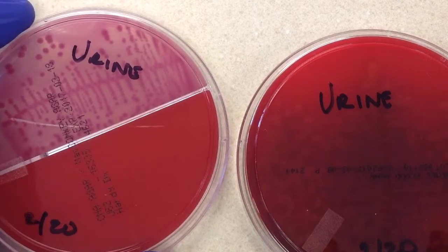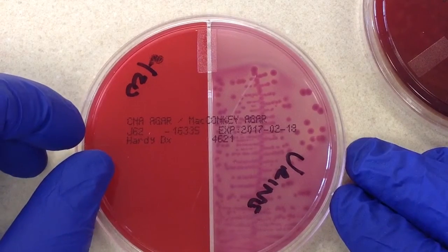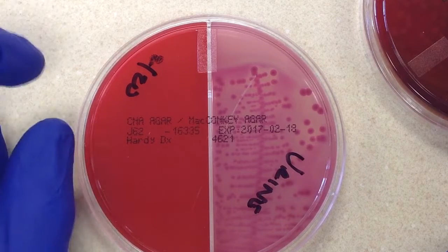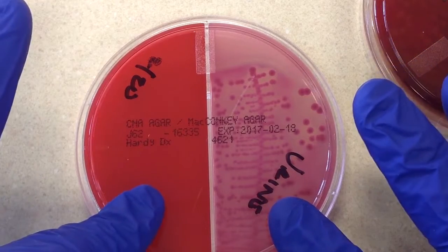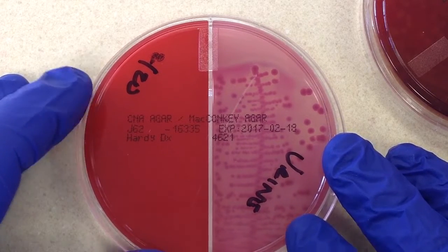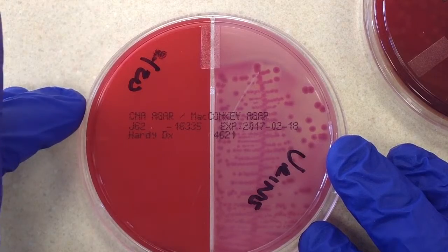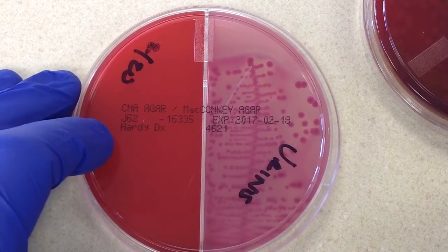With my students I insist they have a clear understanding of media, because media can give you a lot of information about what is growing. We have a CNA/MacConkey's bi-plate. CNA is a selective differential plate — selective means it's selective for gram-positive organisms including yeast, and it inhibits gram-negative organisms. It's differential because one of its differential features is hemolysis.